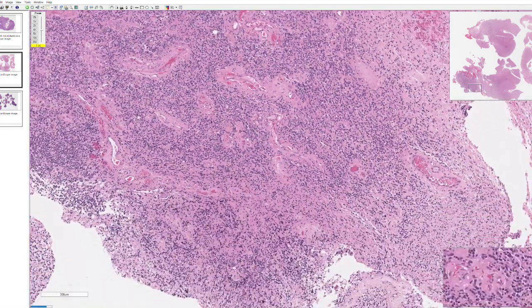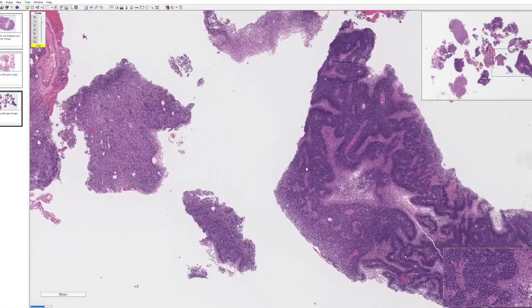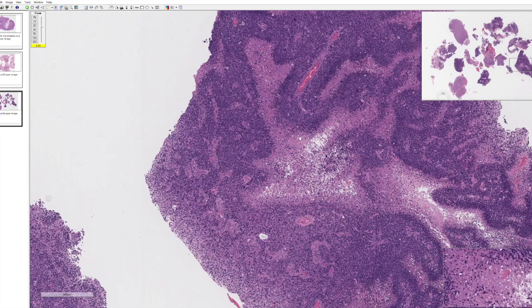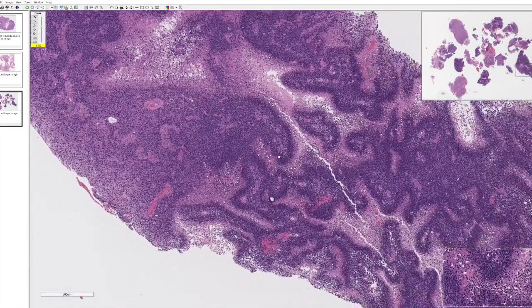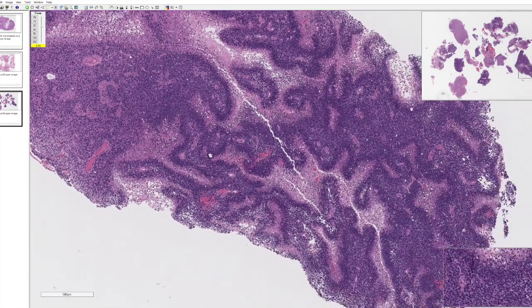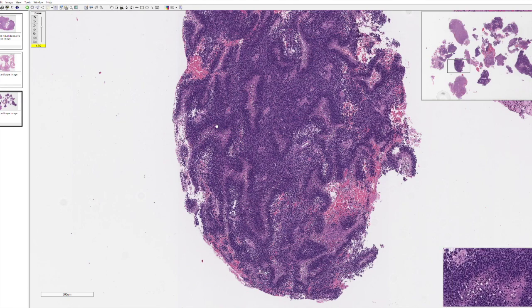In fact, oftentimes, as we see in this second sample here, the tumor actually self-occludes many of these vessels, leading to self-induced tumoral necrosis, as we see here, forming these very characteristic pseudopalisades of cells that surround necrosis. And this is a very characteristic feature of this disease. Here again you see viable tumor cells surrounding areas of more pinkish material where cancer nuclei have died.